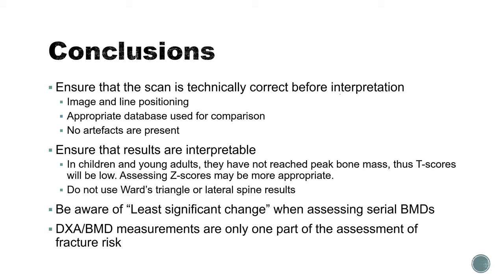Don't panic too much if it doesn't seem to have changed very much, but at least hasn't dropped. So again, you need to be aware of this least significant change. DXA and bone density measurements are really only one part of the overall assessment of fracture risk, and do think about using other measurements to try and get a better holistic risk of fracture for your patient.